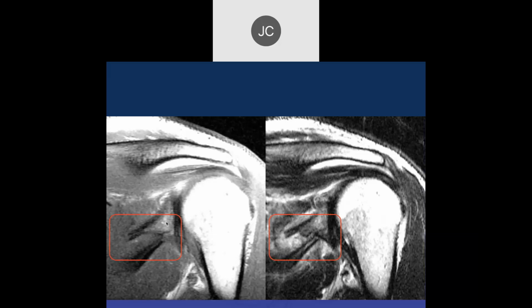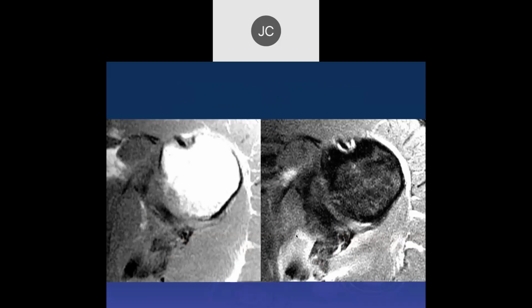Yeah, this is basically the glenoid. Here's the scapula, and there's the scapula. I see, so this is a displaced scapular fracture. Got it. In retrospect, it's kind of obvious that this should be over here, but it's very easy to overlook this. So just kind of put it in your mind. It's the T2 that saves you. Yeah, that's right.